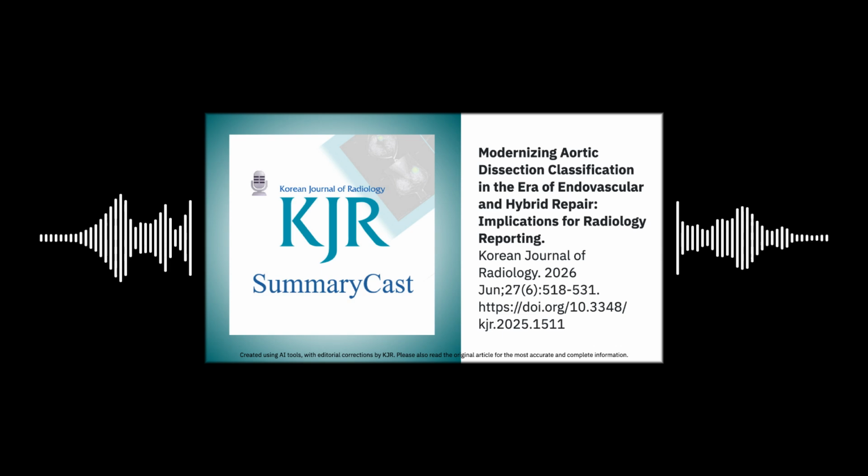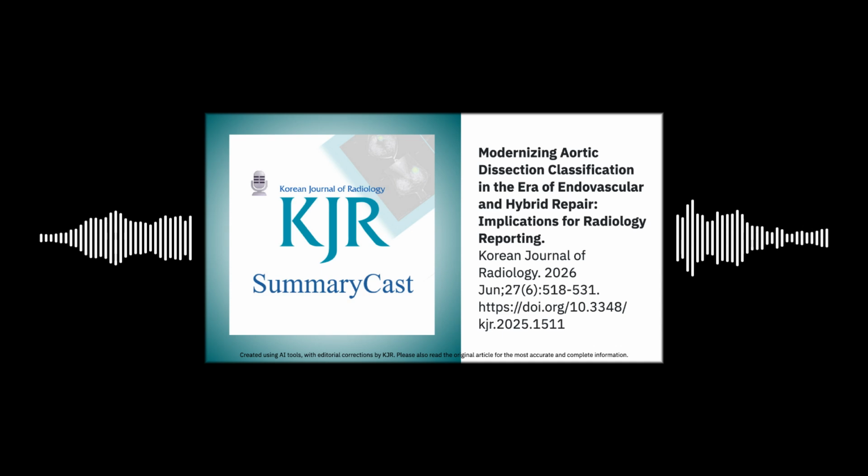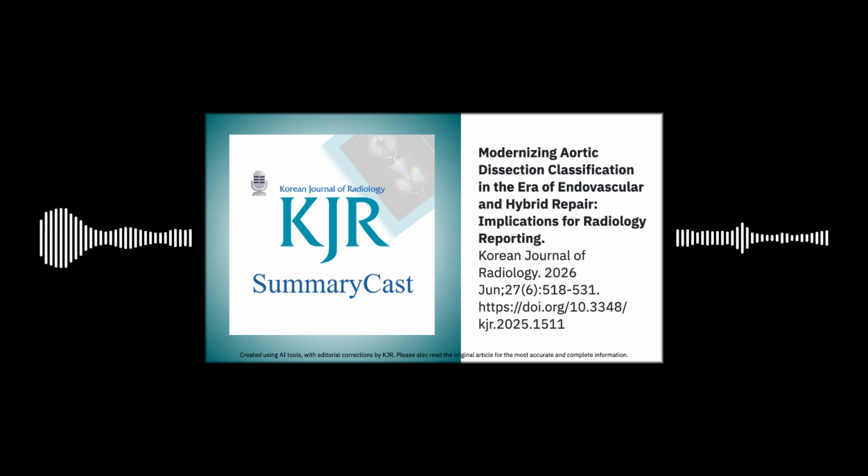Exactly. Finally, the paper stresses the importance of reporting on high-risk imaging features, especially for dissections that might otherwise be considered uncomplicated. What are these features? Table 1 lists them out. They include things like a maximal aortic diameter over 40 millimeters, or a false lumen diameter over 22 millimeters. Also, a large entry tear over 10 millimeters is a red flag.